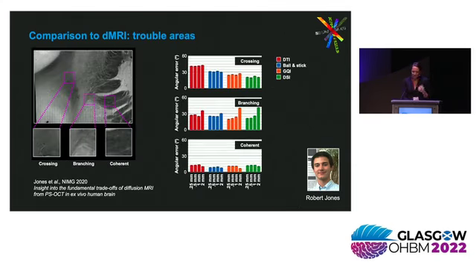So then we looked at different diffusion voxels with different fiber configurations, crossing, branching, and coherent fibers, to see where those effects came from. The jump in accuracy that we see by going from 2 millimeter to 1 millimeter resolution came from the branching areas. There, all the different orientation reconstruction methods, which are shown with different colors, do about the same. The orientation reconstruction method does play a role in the crossing area, predictably, because that's what they're designed to do. But for the branching and, as a sanity check, also for the coherent area, they all do the same.